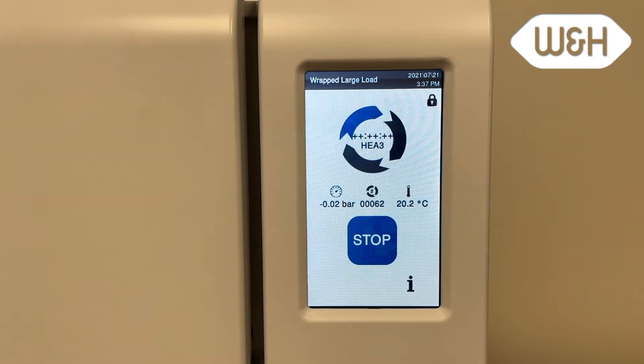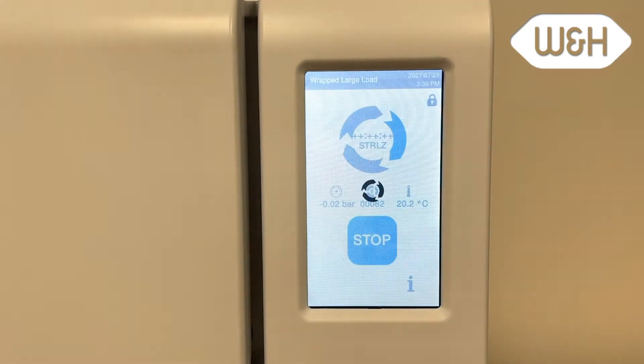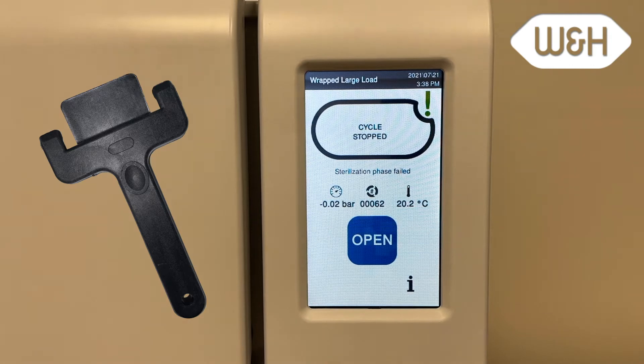An audible beep tone signals when the cycle is complete. Press open to unlock the chamber door and remove the load. Remember, the load will be hot. Use the tray removal tool to remove the trays.